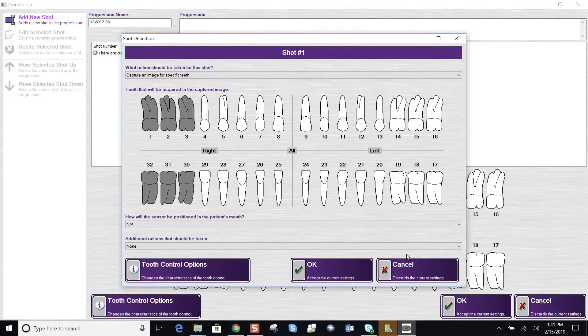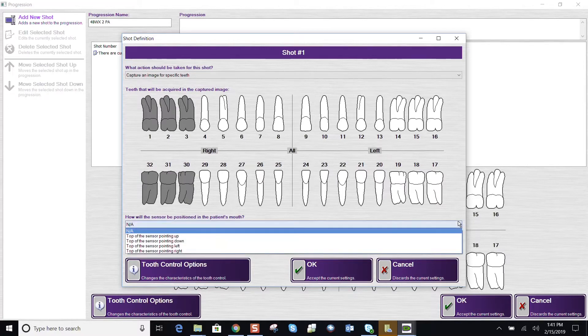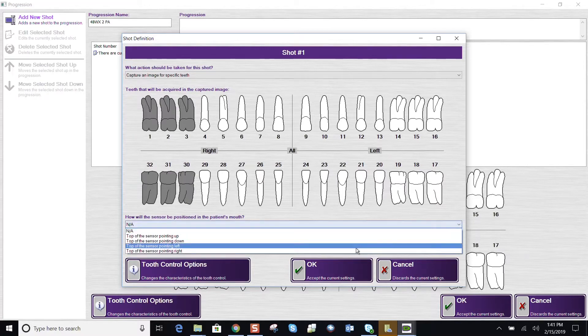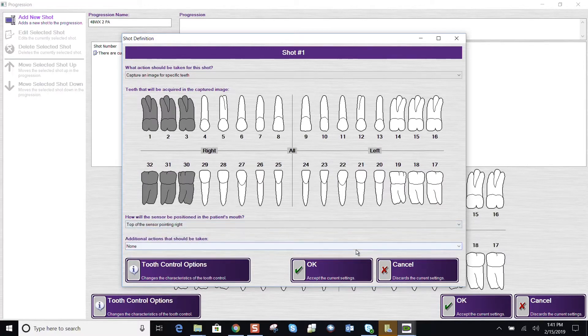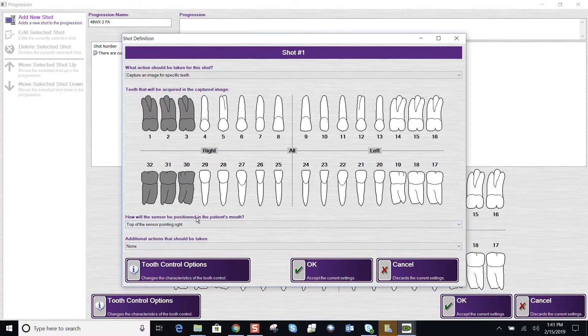is the right side. We're doing the right side. So let's make sure we have that selected. How the sensor is going to be positioned and then we're going to say OK.